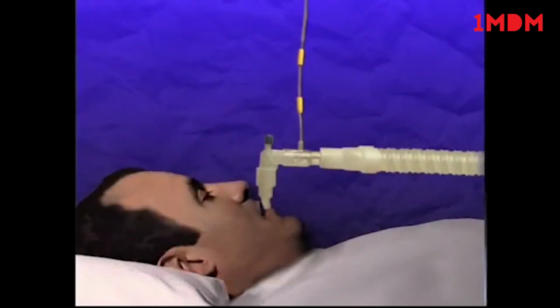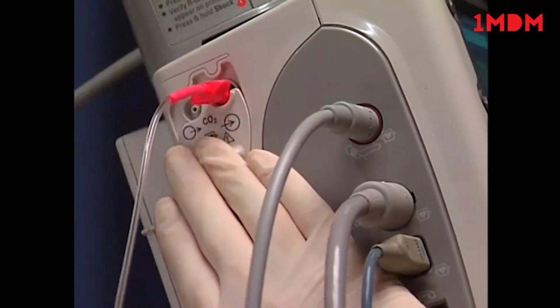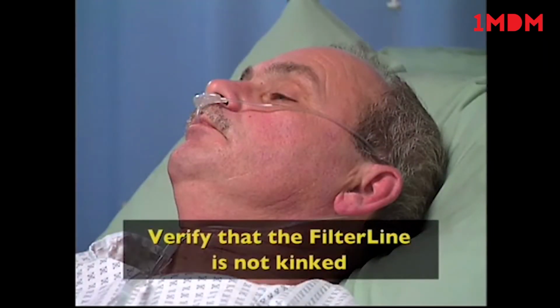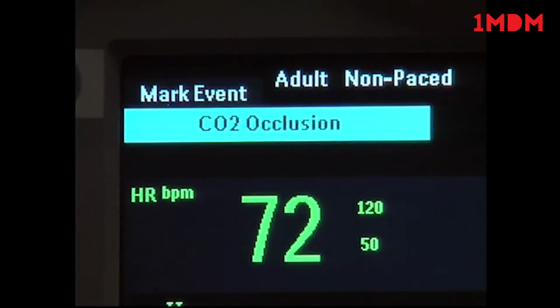When using a filter line set, place the pre-attached airway adapter on the ET tube. Attach the female luer connector of the nasal cannula or airway adapter to the CO2 inlet connector on the measurement connector module. Regardless of type, nasal or intubated, verify that the filter line is not kinked. To remove exhaust gases from the system, connect an exhaust tube or closed-loop kit to the connector. Evaluate the filter line if a CO2 occlusion INOP appears or if the readings become extremely erratic.